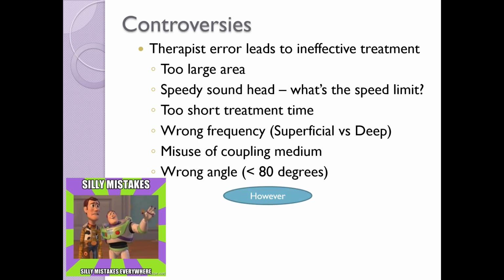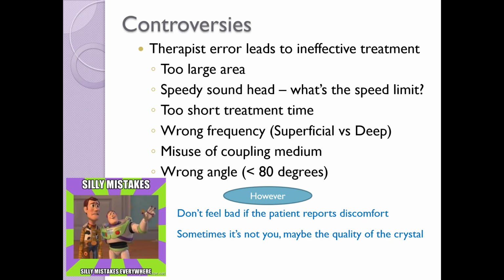As a clinician, remember to do your best and make sure that your patient is comfortable. Do not feel bad if your patient reports discomfort. Modify the treatment and try different things. Also remember that it may not be you. It could be due to the quality of the crystal. The better the quality of the crystal and the lower the BNR, the fewer hot spots and patient discomfort.